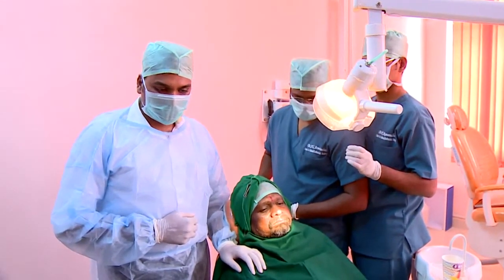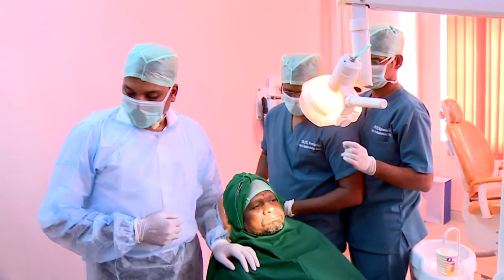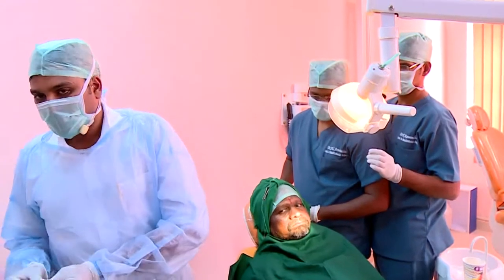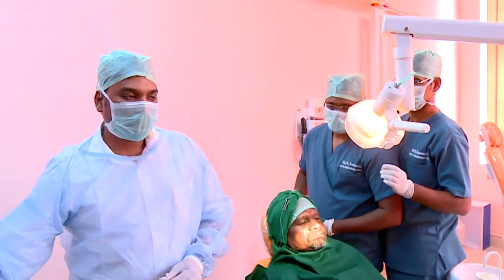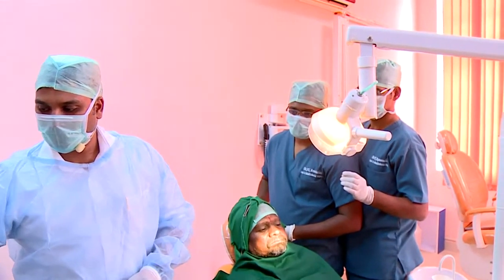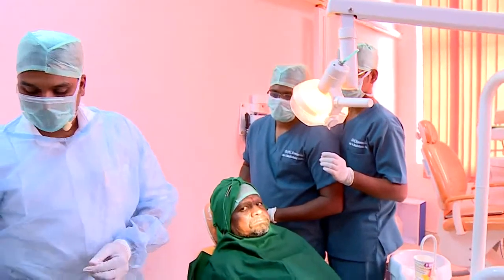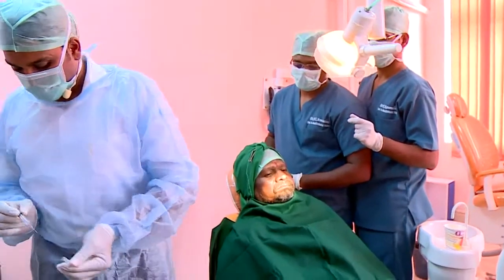Okay. So as we discussed, Dr. Tagore also says that he's going to give a nerve block, and then for local hemostasis, he will slowly infiltrate in and around the areas, but not the area of interest of the biopsy. Because if you give LA into that area, the cell architecture might be altered, so that is what Dr. Tagore was also going to do.